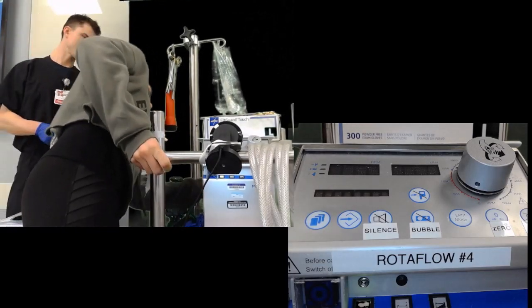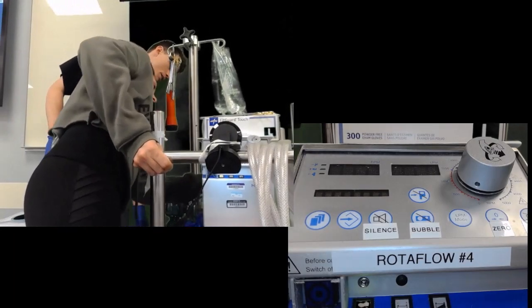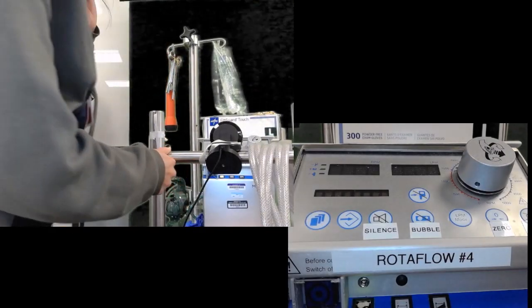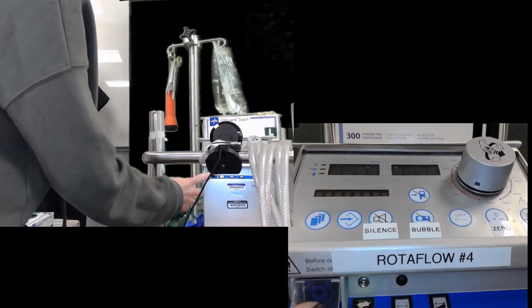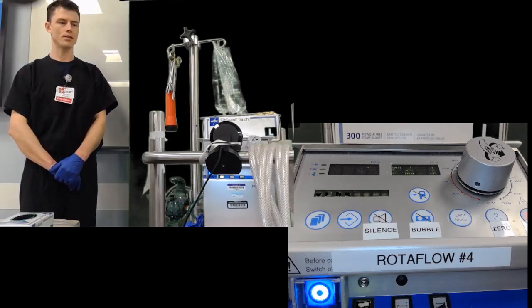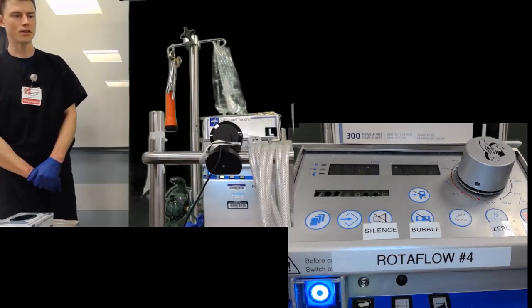There's no switch in the back, or is it this switch? So that's true. There is a switch back there. That one usually needs to be on, but there's a switch right here in the front. It's covered by a little thing so people don't accidentally hit it. All right. You turned it on.